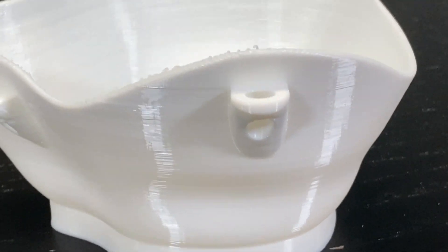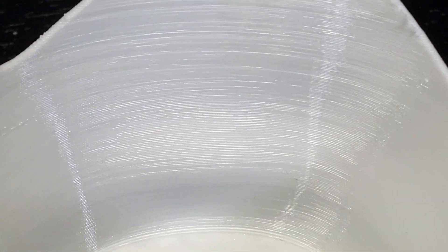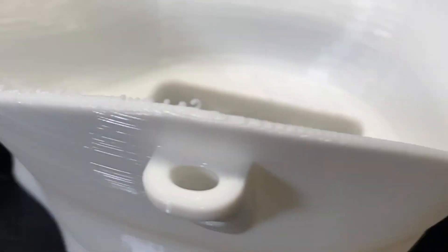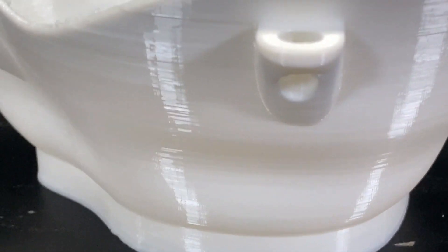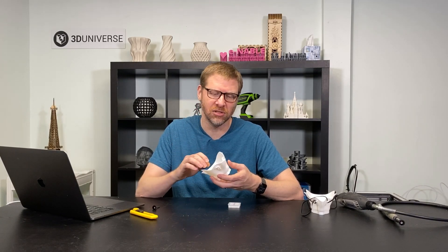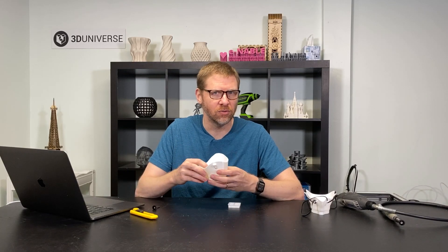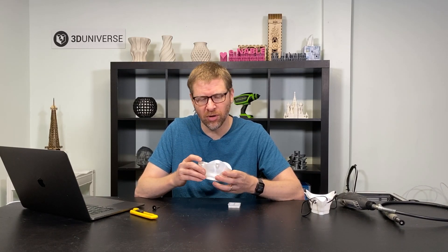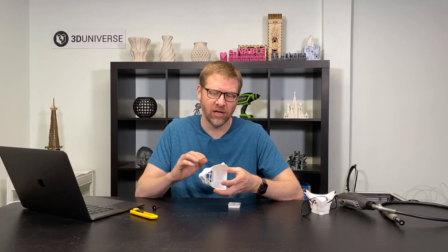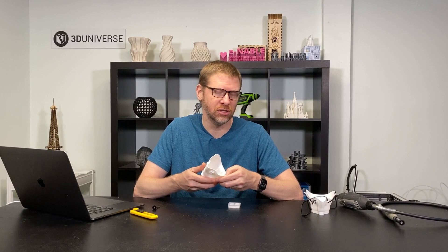This is what the masks should look like when you're getting good quality prints. You shouldn't have any kind of visible gaps or significant imperfections. There might be some minor imperfections in the surface — some little pock marks or indentations are okay — but anything more significant that looks like it might allow air to get through would be a significant problem. You want really nice layer stacking, good clean layers, and a pretty smooth surface finish overall.